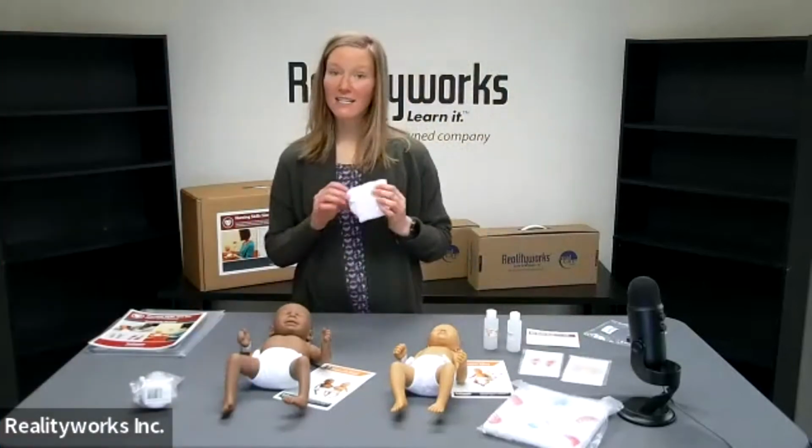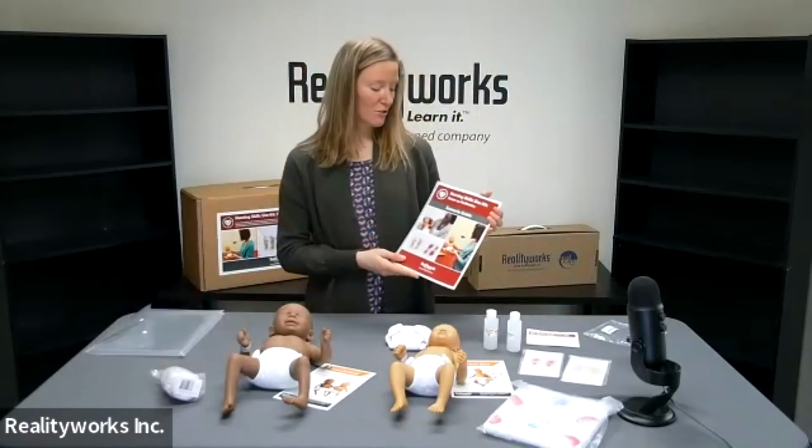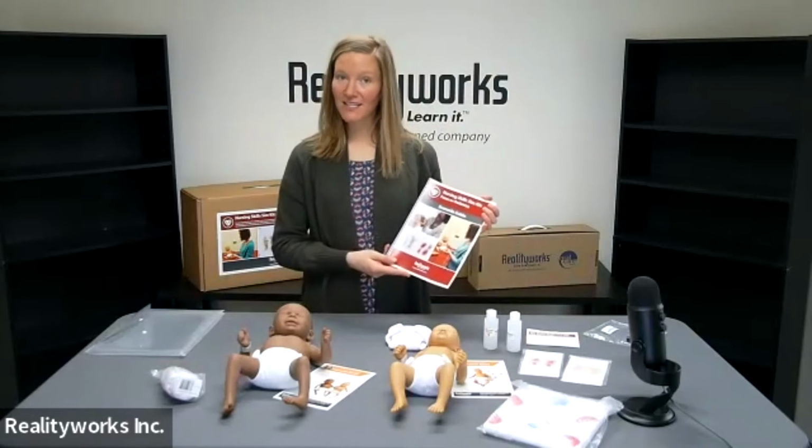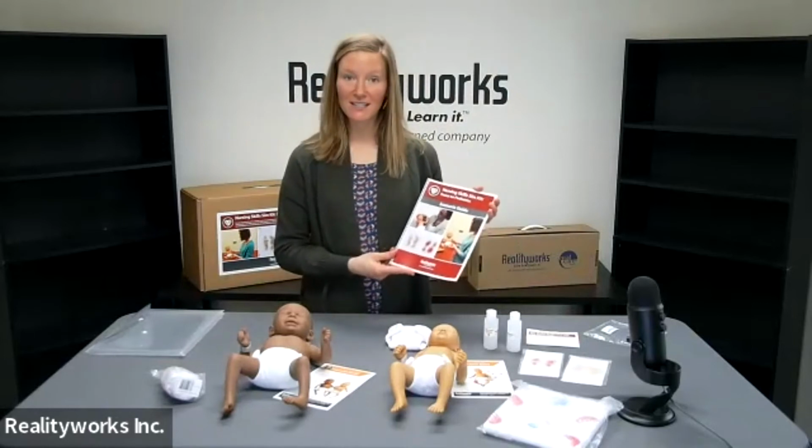You'll also get a diaper, a bottle, and of course, you'll get your scenario guide, which includes your handouts, step-by-step facilitation instructions, environmental prop list, and everything else you need to facilitate these scenarios.